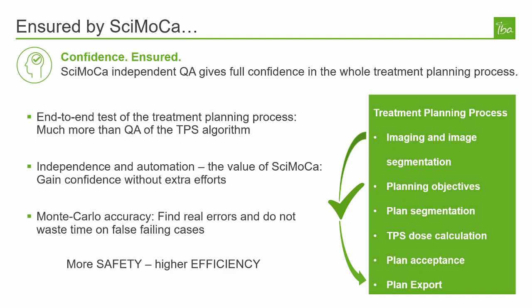The results of a SciMoCa calculation for a patient plan offer peace of mind across the whole treatment planning process. This is because SciMoCa is capable of serving as an end-to-end test from imaging to plan export. If we think back to the statistics from the World Health Organization at the start of this presentation, this means that SciMoCa can provide peace of mind for nearly 90% of the incidents they observed.